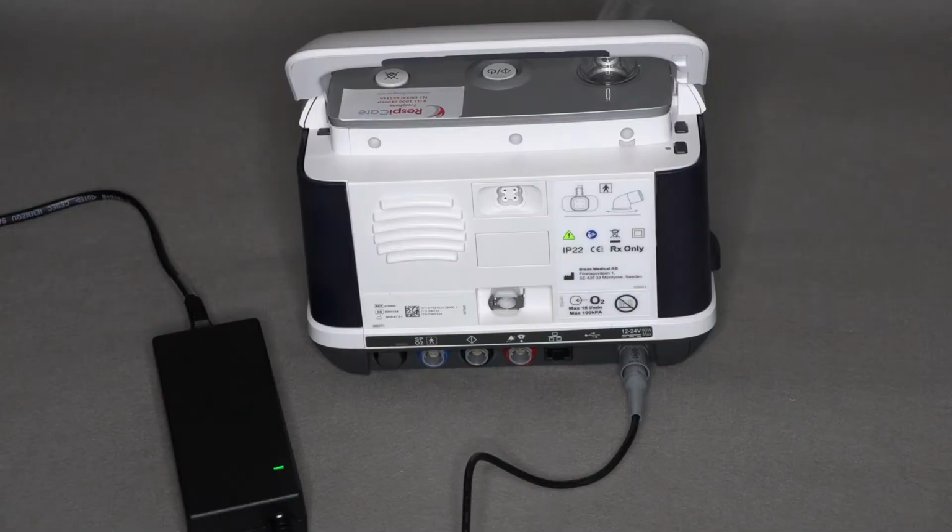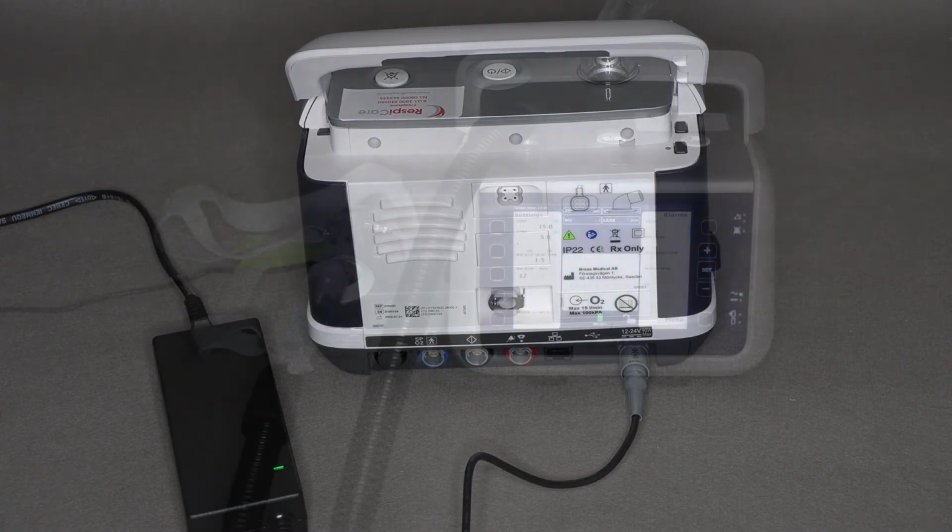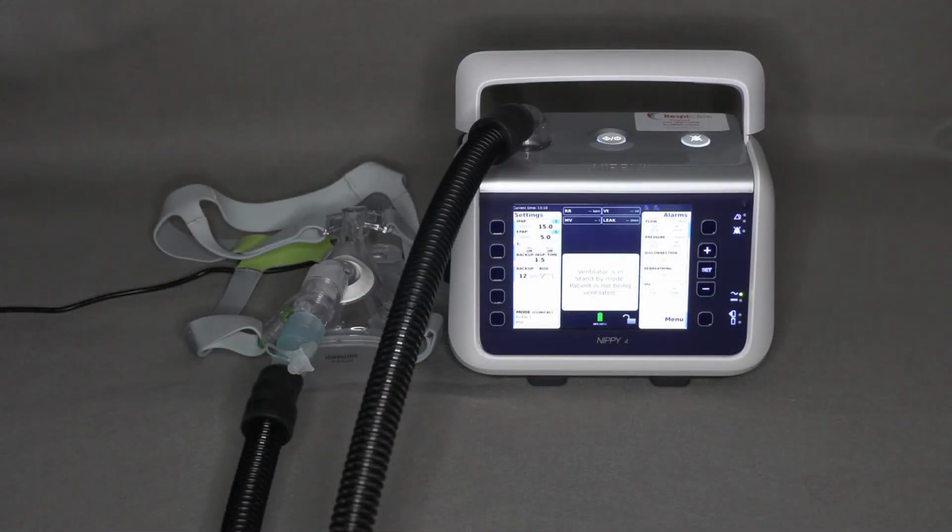It's always best to leave the device plugged in and connected to electrical power even when it's not in use, as this ensures your battery is kept full for a time when you may need to rely on it.